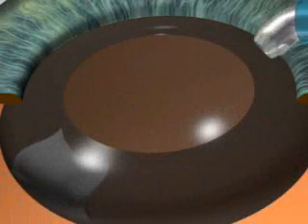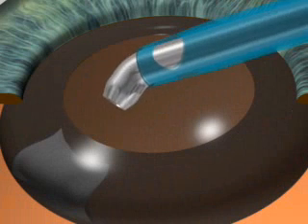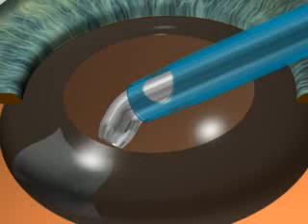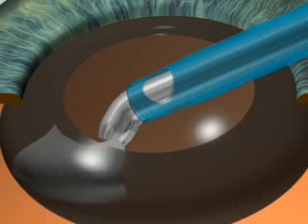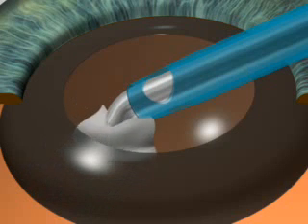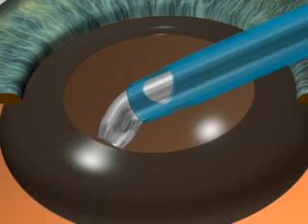Aspiration of cortical remnants. Using the irrigation aspiration tip, residual fragments of lens cortex are aspirated from the capsule.